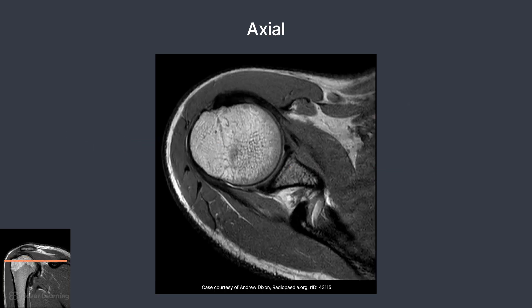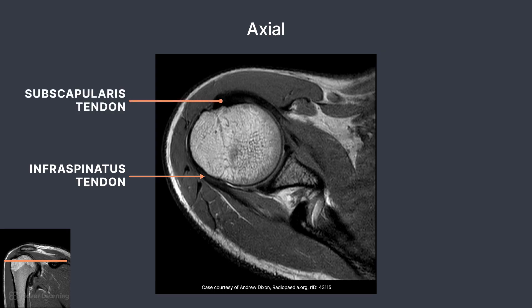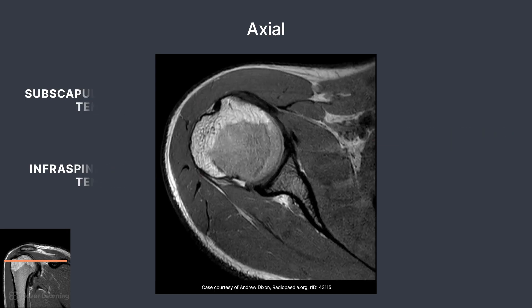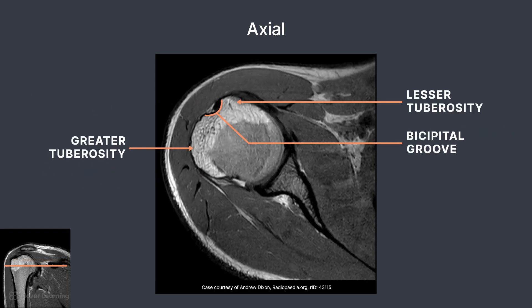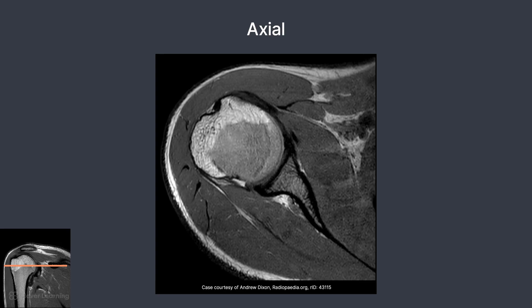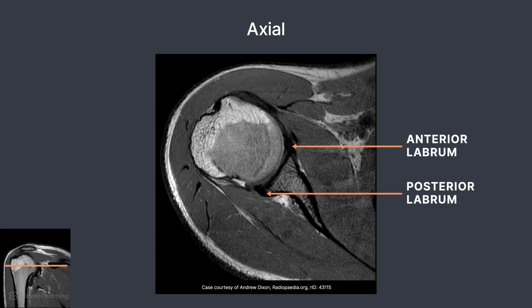Important tendons of the rotator cuff are demonstrated here. On the posterior aspect of the joint, the infraspinatus tendon is demonstrated as a dark line. On the anterior aspect of the joint, the subscapularis tendon is demonstrated wrapping on the front of the humerus. It is important to remember the subscapularis muscle is located between the ribcage and the scapula. The prefix 'sub' means under, so you can remember the subscapularis muscle is located underneath the scapula. Here we see the lesser tuberosity, greater tuberosity, and the bicipital groove. The biceps brachii long head tendon sits in the bicipital groove. On the axial view, we can see the anterior and posterior labrum as darkened triangular areas. Remember, the labrum is a ring of cartilage in the joint space.